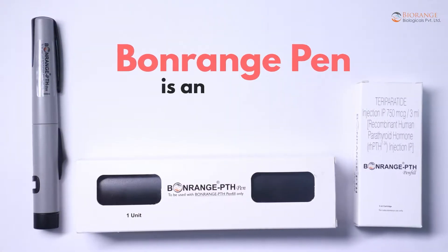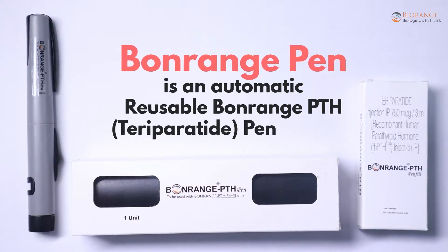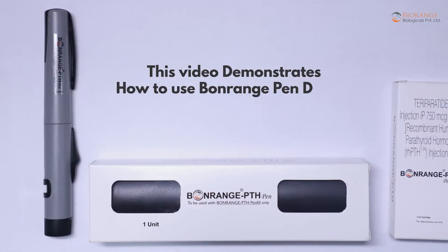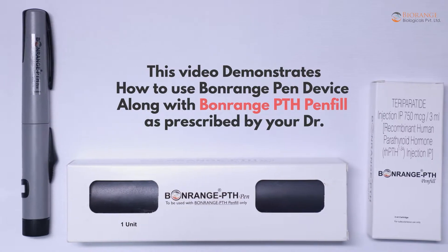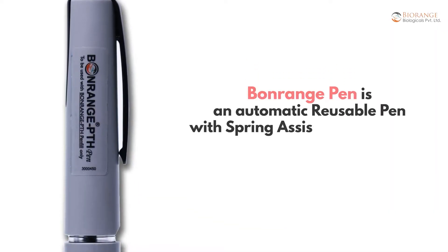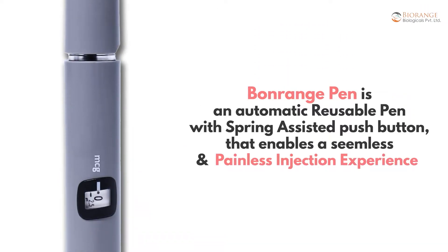Bonrange Pen is an automatic reusable Bonrange PTH teriparatide pen injector. This video demonstrates how to use the Bonrange Pen device along with Bonrange PTH pen fillers prescribed by your doctor. Bonrange Pen is an automatic reusable pen with spring-assisted push button that enables a seamless and painless injection experience.